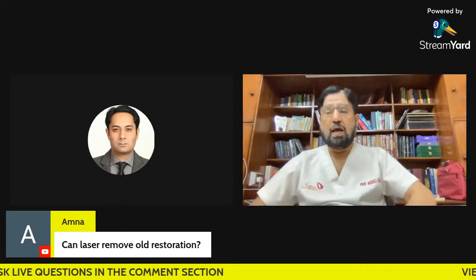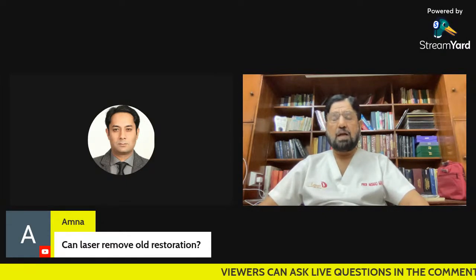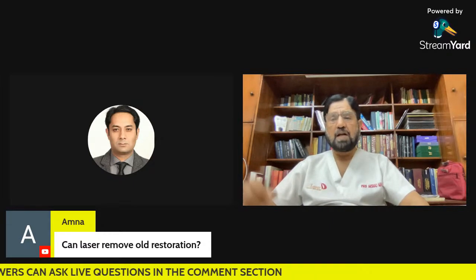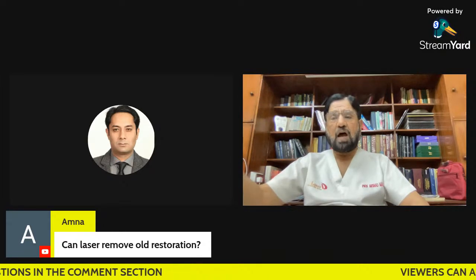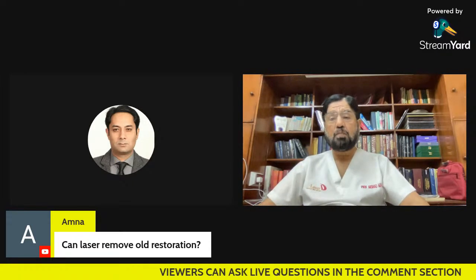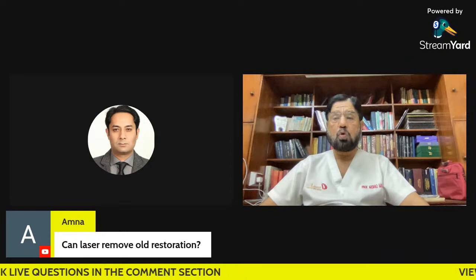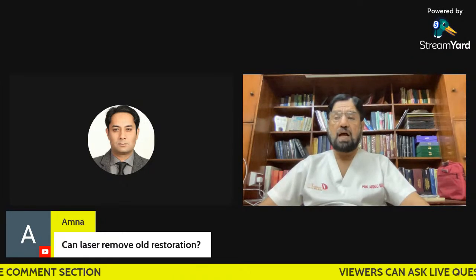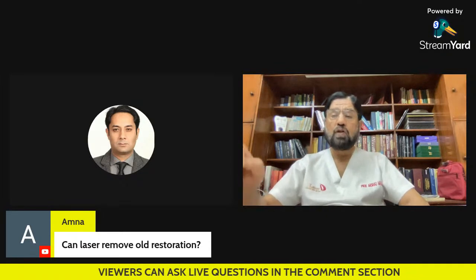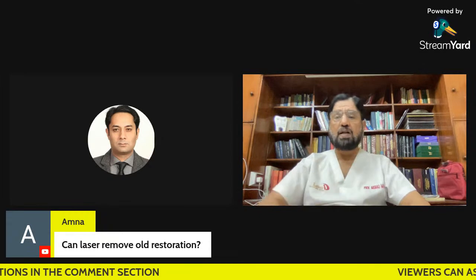When I started carbon dioxide laser in my master's degree, when I did MDS, my topic was a comparative study of wound healing after partial glossectomy by carbon dioxide laser versus scalpel. The people who claim today that they are laser specialists had not even been born at that time. In the Atomic Energy Commission Islamabad, we generated our own carbon dioxide laser, started the experiment on Sprague Dawley rats and did the partial glossectomy, and we proved that the 3-watt carbon dioxide laser is more effective than the 6-watt.